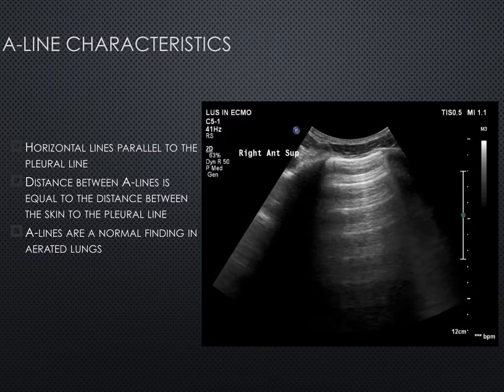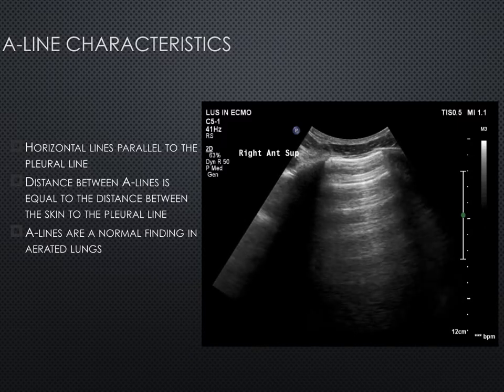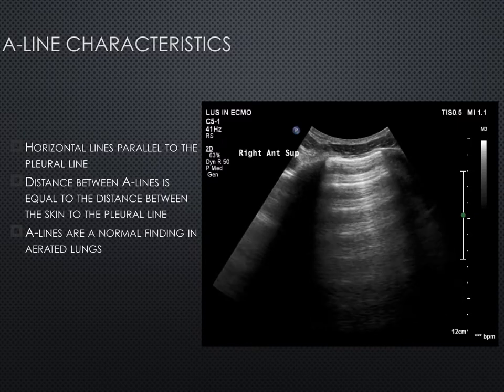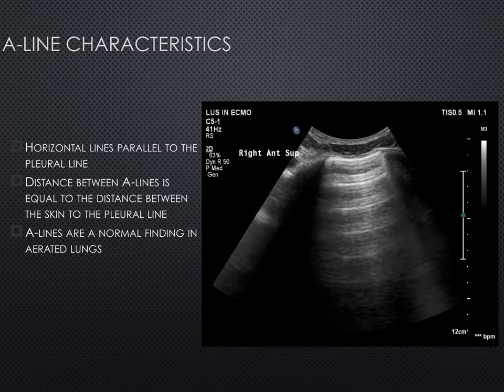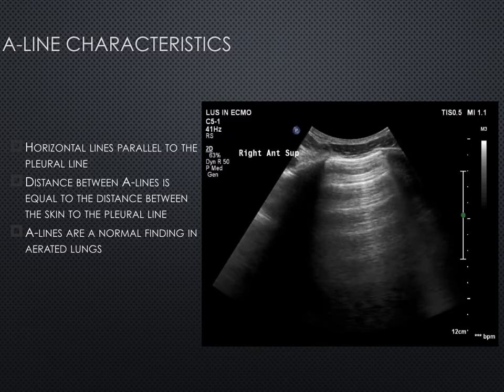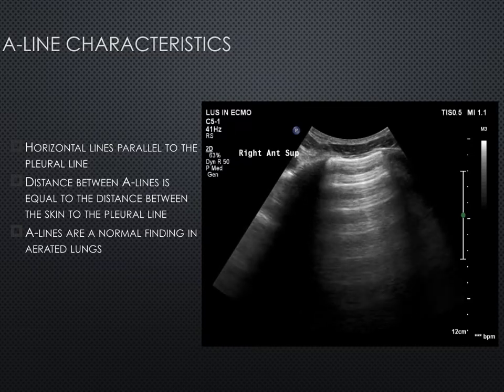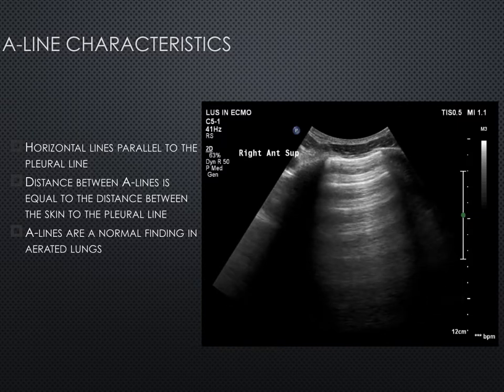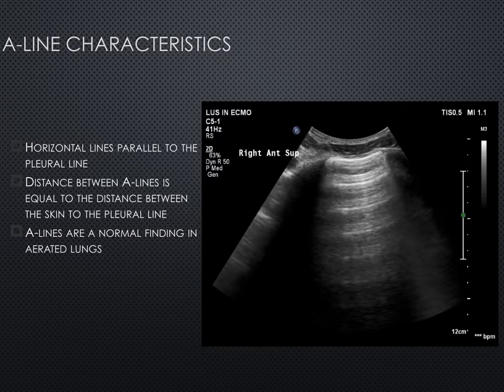It's telling us that this area of the lung is aerated. There's not a pneumothorax there because there's connection between the two pleura, and there's movement of that pleura as well. So there's change in the volume of the lung tissue underneath. So there's aeration of that lung. And this is what you should be seeing in a normally aerated lung. However, it would change slightly if we looked at a deaerated lung, or a lung that has more fluid than air.